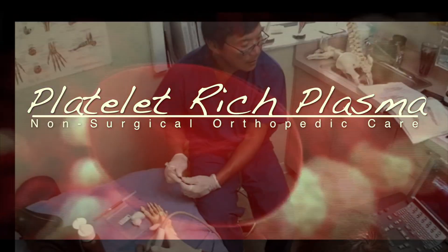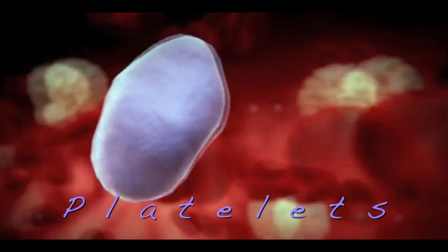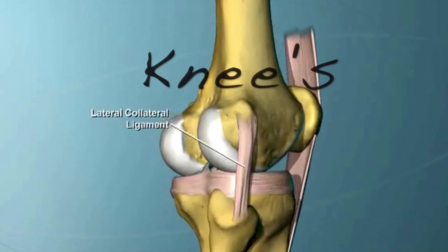Platelet Rich Plasma. Your blood contains these small discs called platelets, and along with the plasma, both are rich in growth factors and stem cell potential. These can be injected into damaged, injured, and arthritic knees.